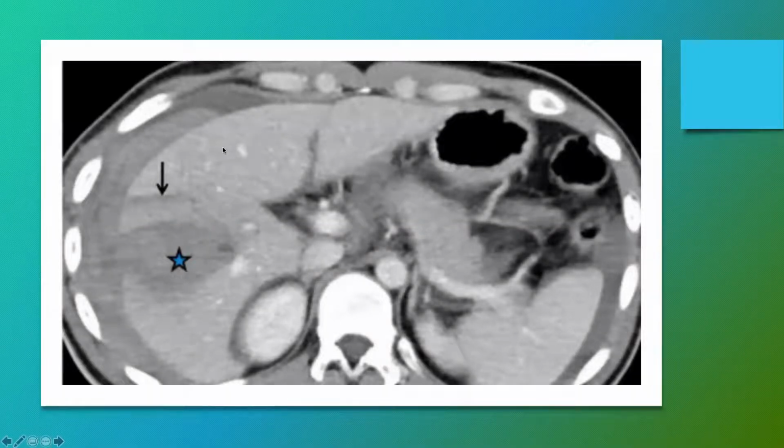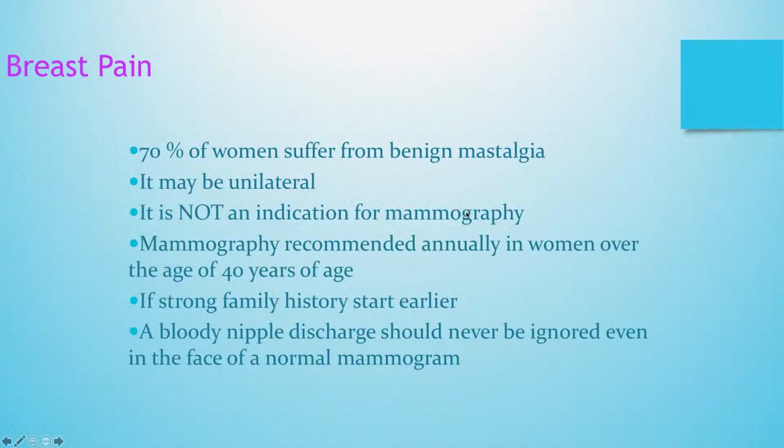And of course, I didn't forget. Here it is. I put a reminder to myself. I forgot to take out the reminder. And here you see this patient who had an abdominal injury, and they have a liver laceration with a hematoma in the liver, that's parenchymal, and a subcapsular hematoma. There's some free fluid here. On this slice, we're not seeing any other organ damage.